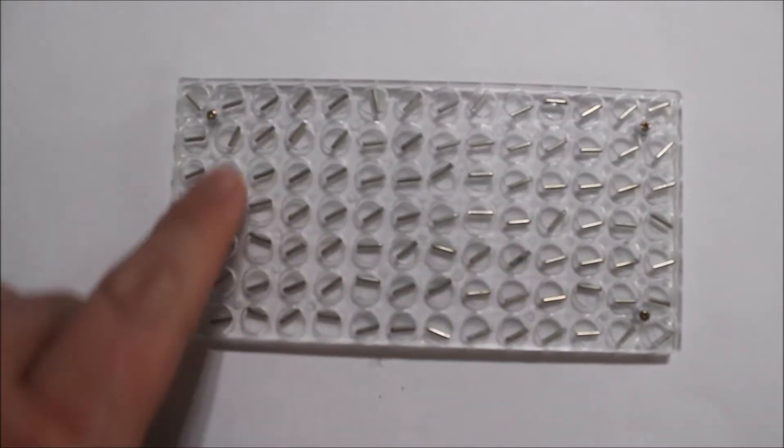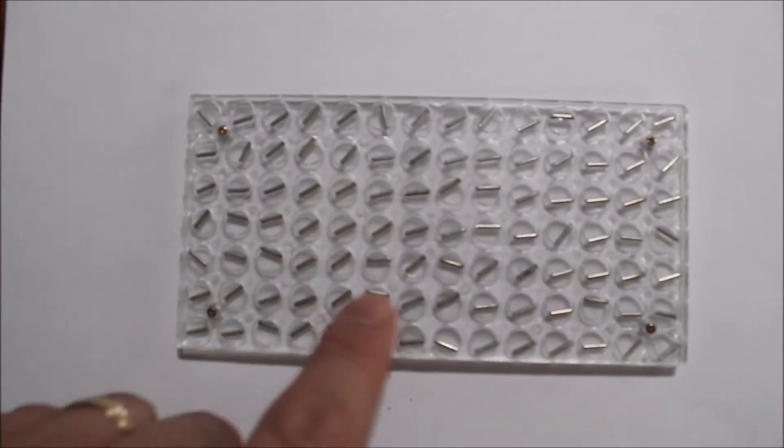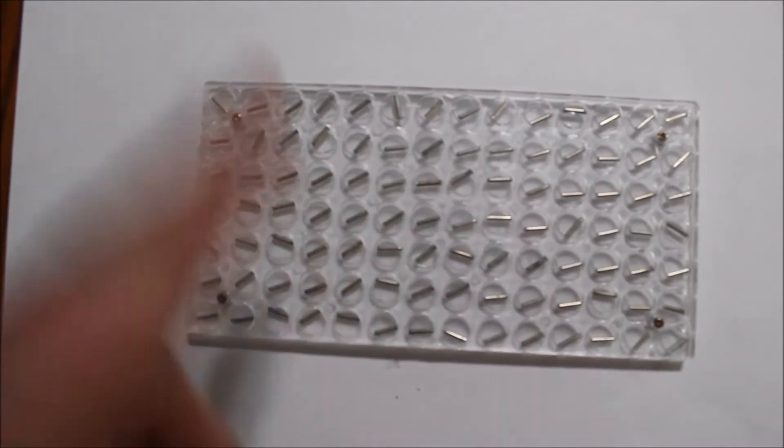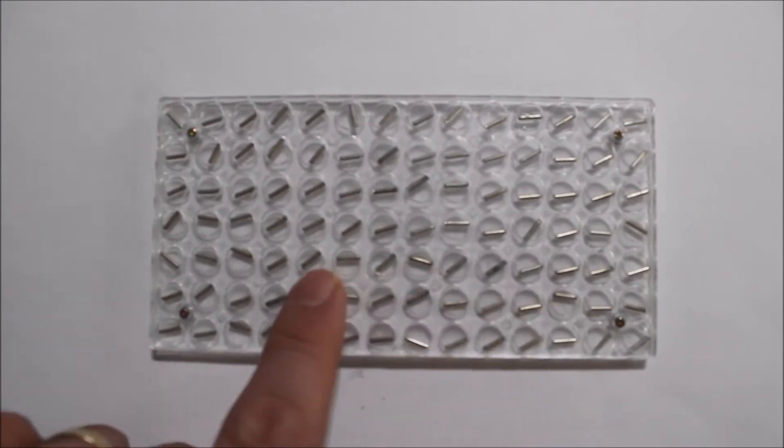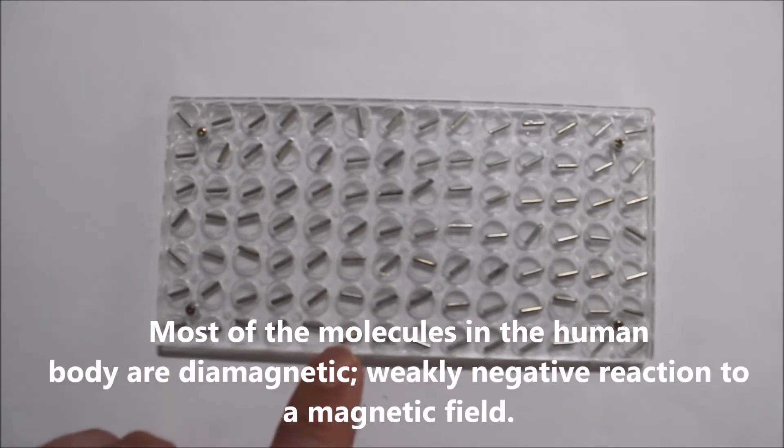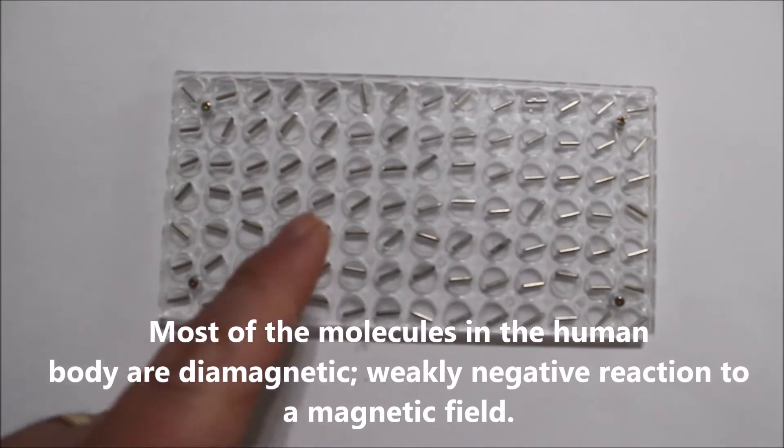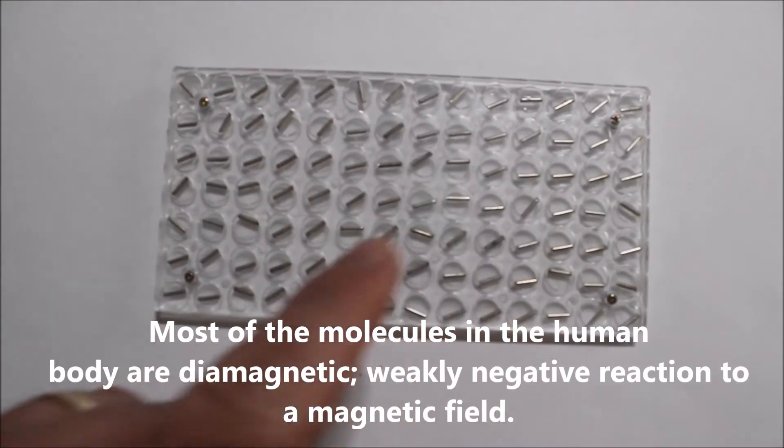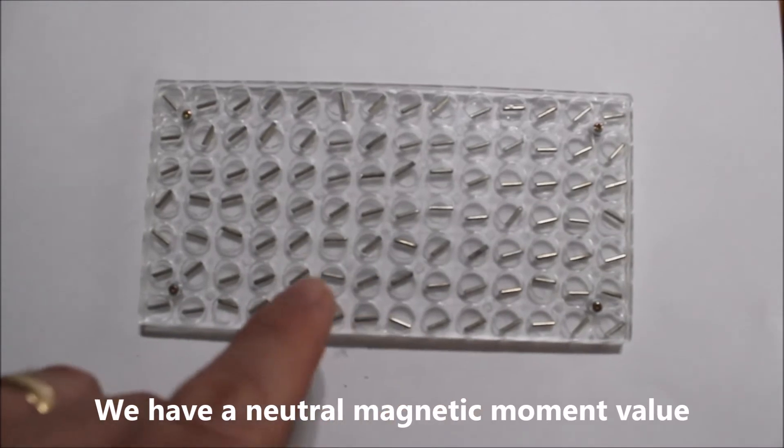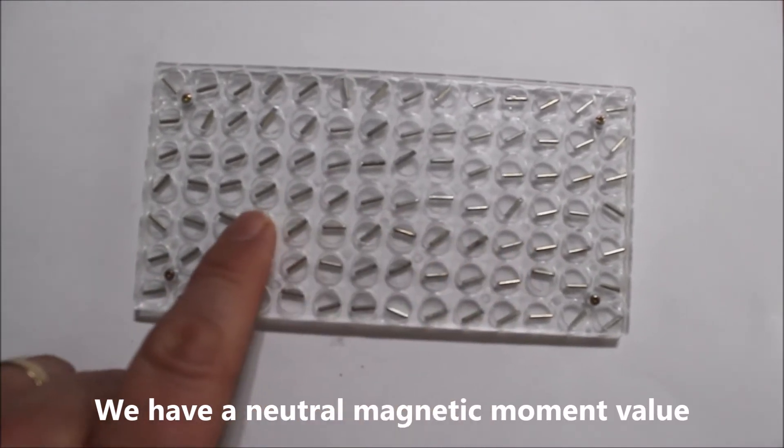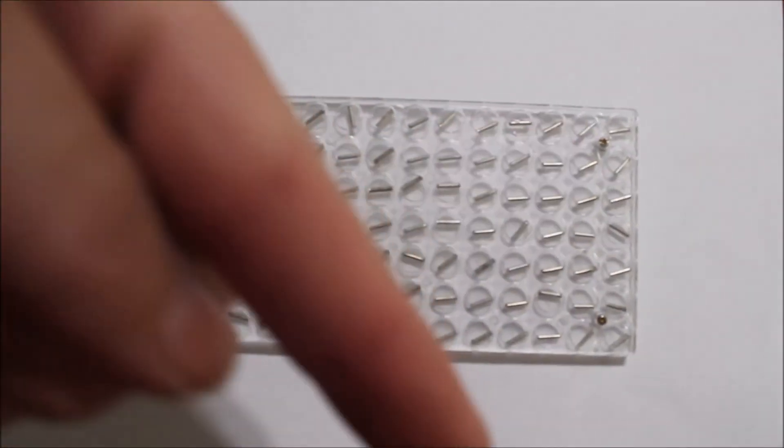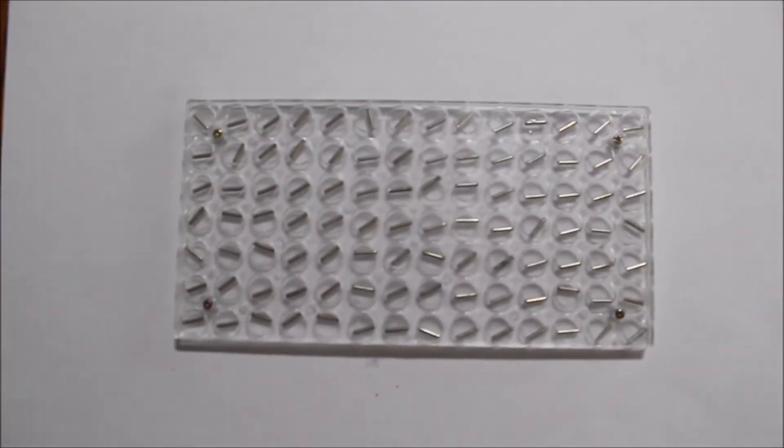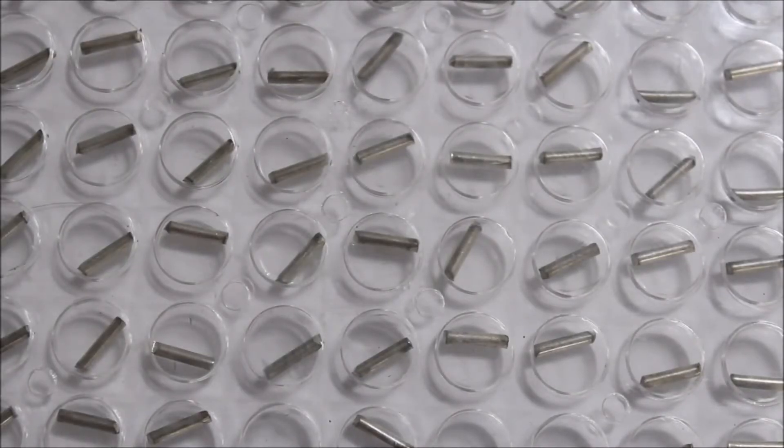So first of all, we notice that all the iron bars here, the steel bars, are in a different orientation. Some are pointing up, some left, right, any obliquity within the system. That's why we are not magnetic when we're walking around, because all these spins or poles are looking in or spinning in a different direction, so everything cancels each other out.